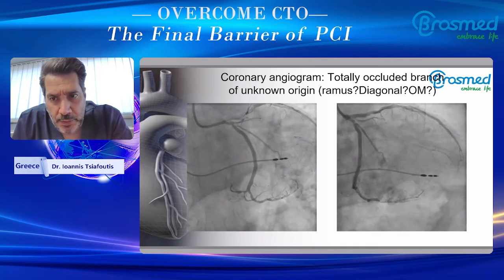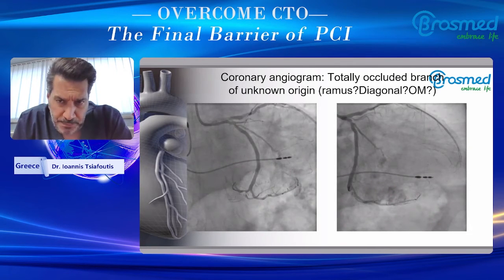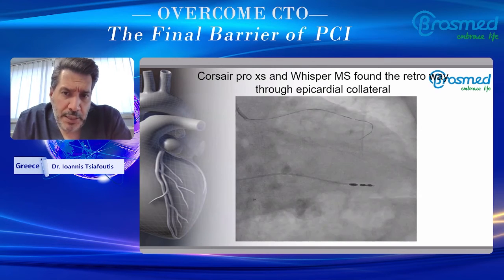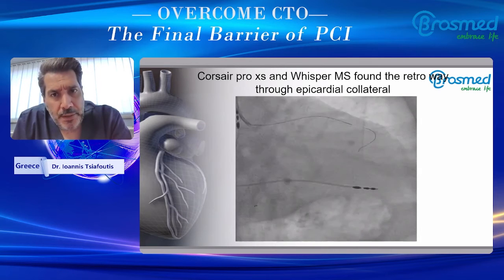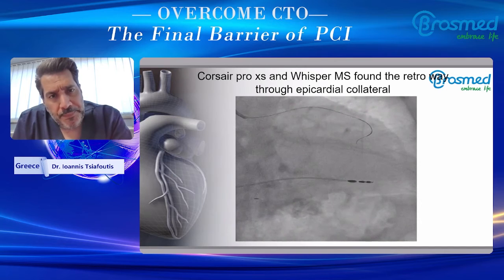So we had to recanalize, and we decided to use an epicardial collateral from the LAD to go retrogradely with Corsair Pro XS and Whisper MS wire.